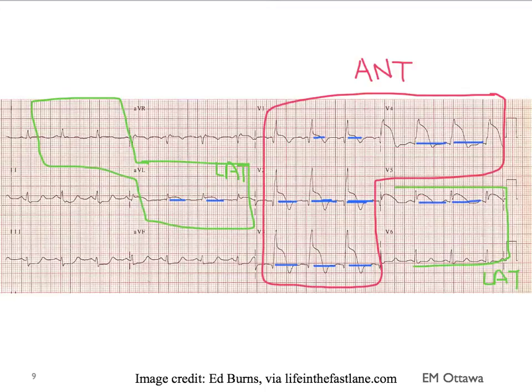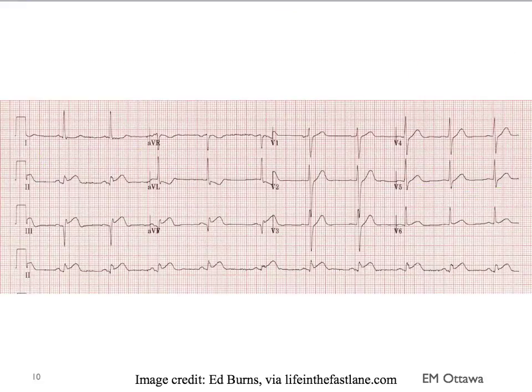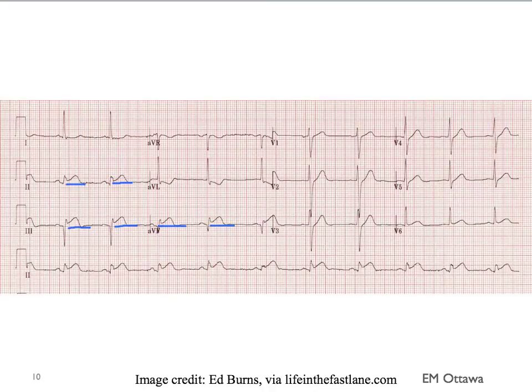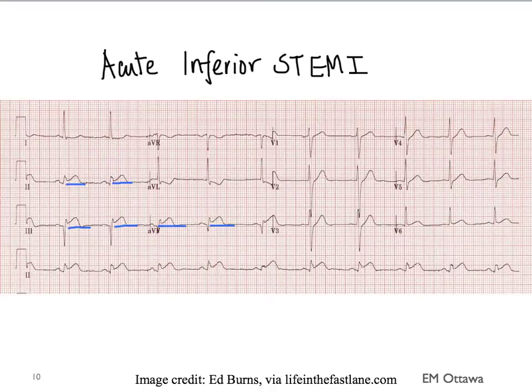Every time you see ST elevations belonging to the same territory, you have to think there is a blocked vessel and therefore an infarction. Looking at another ECG — the ST elevations are in leads 2, 3, and AVF, which is the inferior portion of the heart. Therefore, this is an acute inferior ST elevation myocardial infarction.